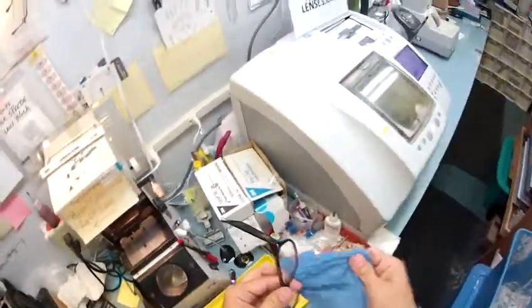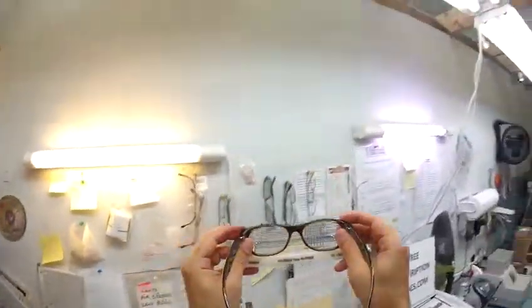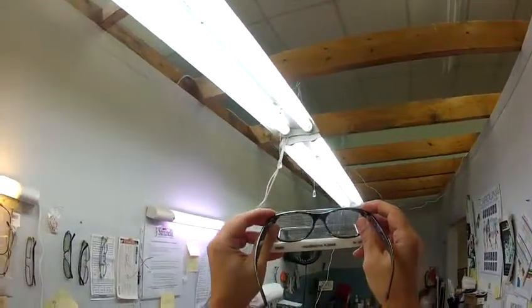And again, I'm going to dry everything off and do a quick inspection. Perfect. I'm going to use my graph to make sure that both are on the same line. Perfect, dead on. We're looking good there.